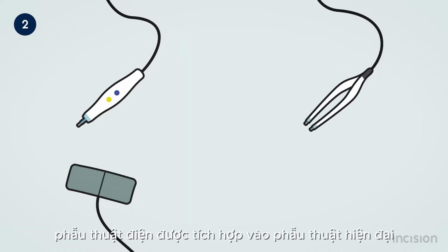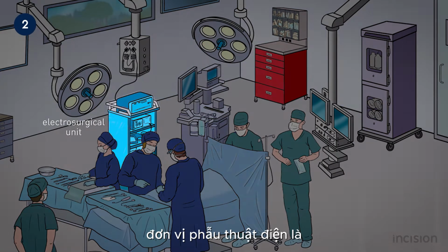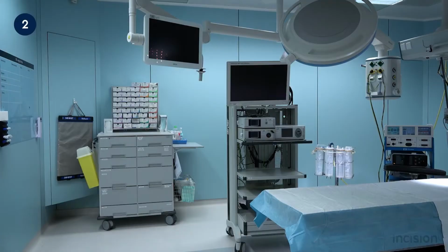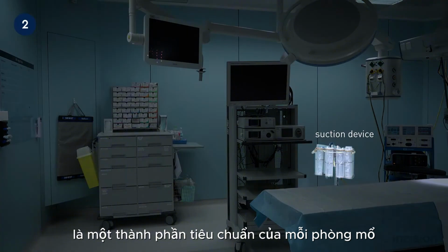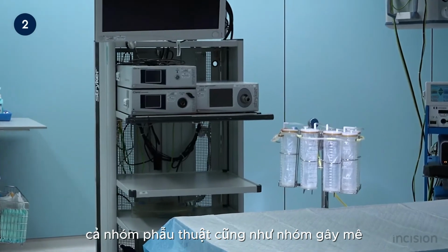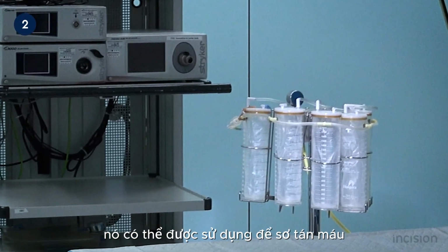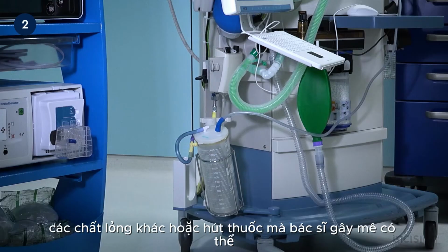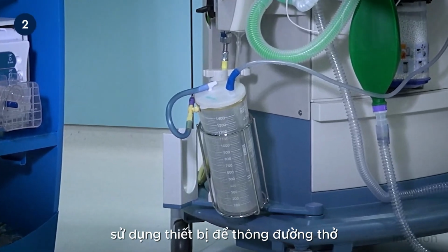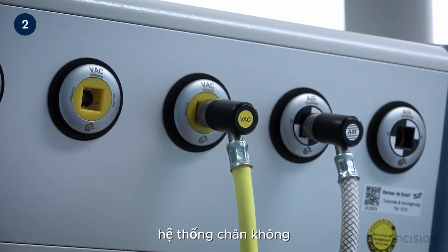Electrosurgery is integrated into modern surgery and part of most procedures. The electrosurgical unit is therefore a standard component of the operating room. A suction device is a standard component of each operating room. Both the surgical team as well as the anesthetic team use the suction device. During surgery, it might be used for evacuating blood, other fluids, or smoke. The anesthesiologist might use the device to clear the airway. The suction device is connected to an integrated vacuum system.